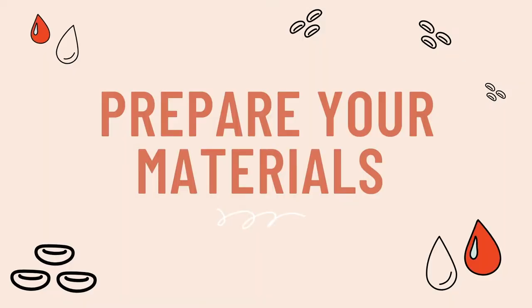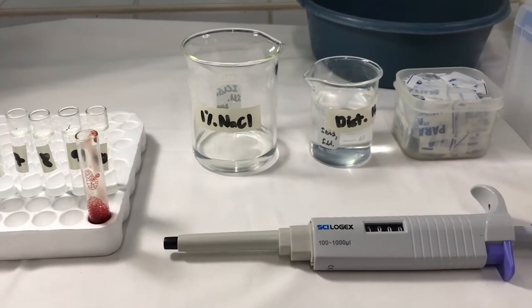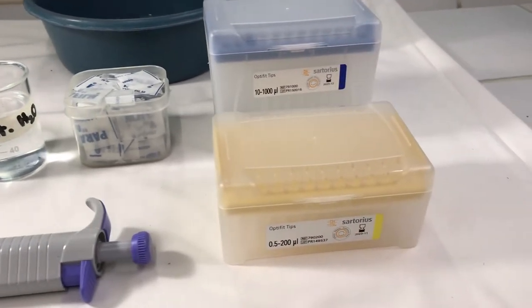Next, gather the materials you will need: glass test tubes labeled from 1 to 12, our defibrinated blood sample, a 1% sodium chloride stock solution, distilled water, an automated pipette, and of course, our pipette tips.